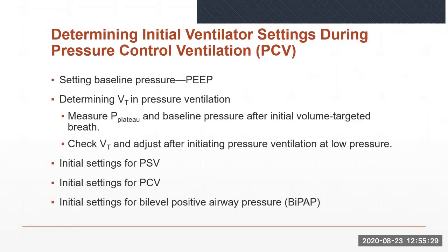Normally, pressure control CMV provides a descending ramp waveform. As with pressure support ventilation, or PSV, current generation ventilators are able to adjust the inspiratory rise time, which is the amount of inspiratory time required for the ventilator to reach set pressure at the beginning of inspiration. The practitioner can adjust the rise to meet patient needs as with PSV. It is advisable to use graphic monitoring to help make adjustments in pressure, I time, and flow taper. If I time is too long and the patient starts to actively exhale, a slight rise will occur at the end of the breath on the pressure curve.